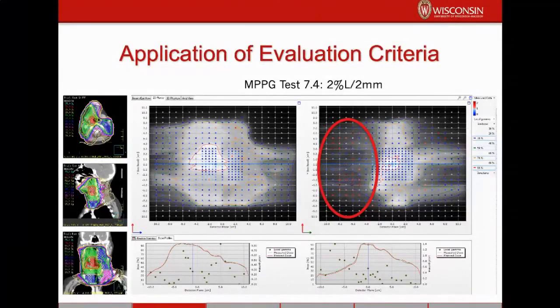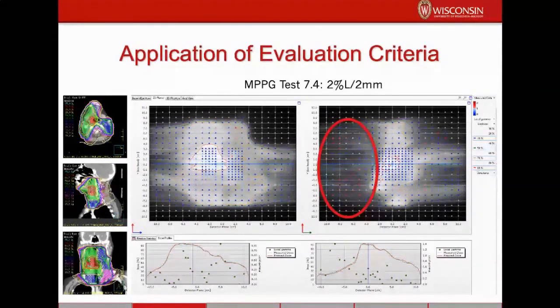And so patient-specific QA very often misses some important parts of the treatment planning process, like taking a CT scan of something and importing it into the treatment planning system, applying an image value to density table, and things like that. Generally, patient-specific QA doesn't interrogate the model for heterogeneity corrections either. Most of our patient-specific QA phantoms are designed to be as homogeneous as possible. And so, we don't generally test heterogeneity correction as part of routine patient-specific QA.